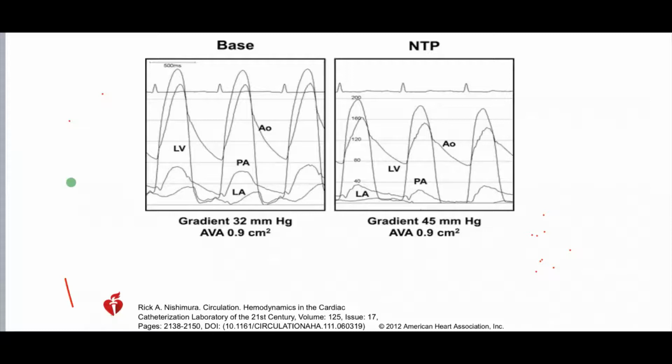And that's why when you treat hypertension, the diastolic LV function will improve and the gradient might increase, like in this case. After giving nitroprusside, we remove the high blood pressure, we enhance the flow across the LV because we improve the relaxation, and that leads to an increased gradient. So hypertension underestimates the gradient.